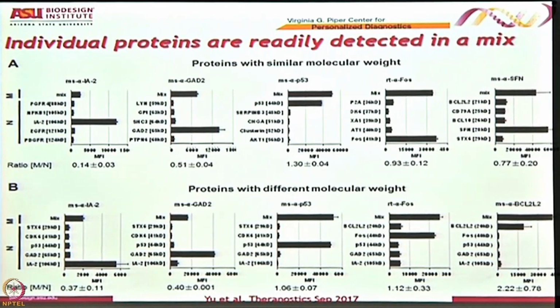That showed us that the system was basically working. Now, in this top experiment, we tried to restrict the study to proteins of similar size. So these are all around 100 kilodaltons. These are around 60 kilodaltons. These are around 50. You can see that they're roughly different sizes. So we tried to group the proteins by similar size to avoid that problem I described earlier.